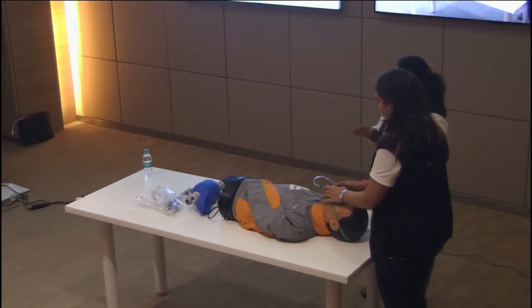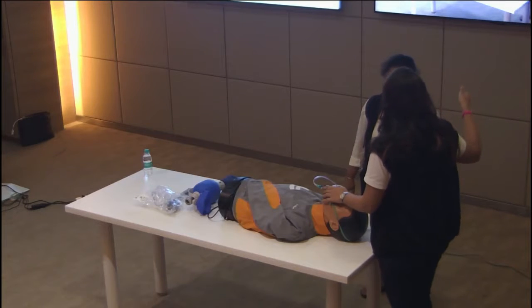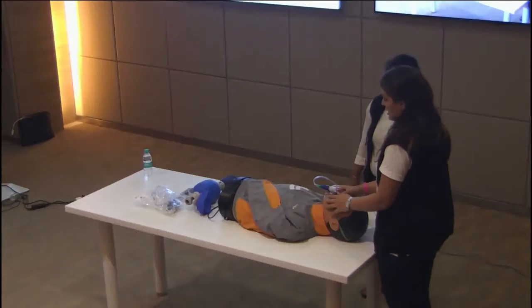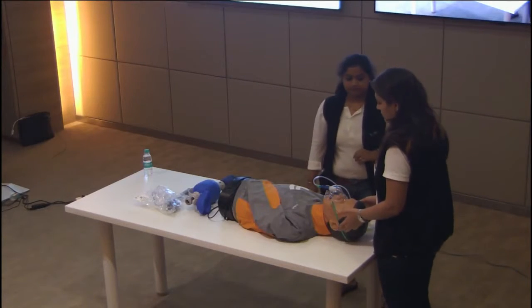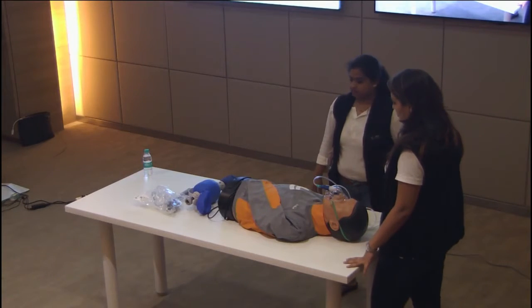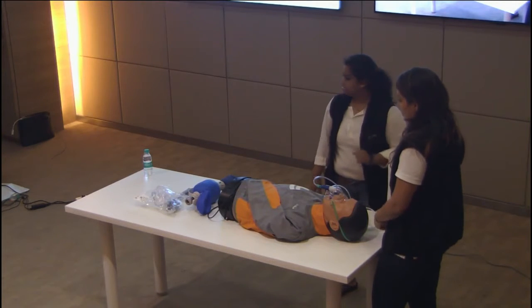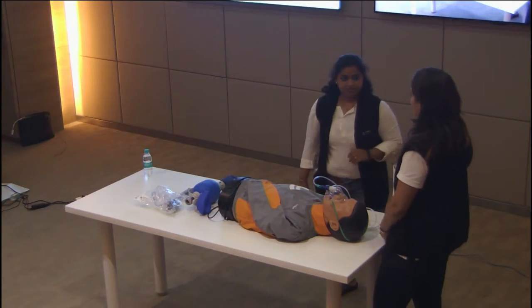Enacting of the NRBM. So we'll give the oxygen up to 15 liters. We'll see the reservoir bag. It has to be completely filled up. And that's our hope. Let's see. We are losing our precious time here. I don't think we should wait for a long time, but just wait and we'll decide in this some time whatever can be done. Vitals we see. All right, all right.